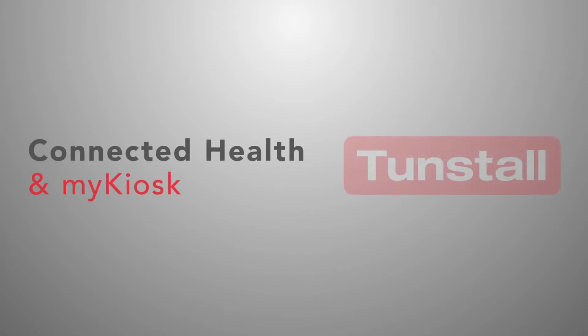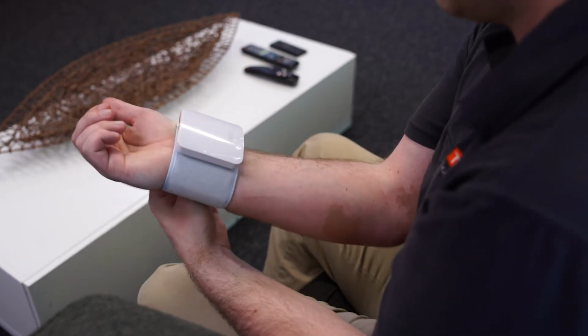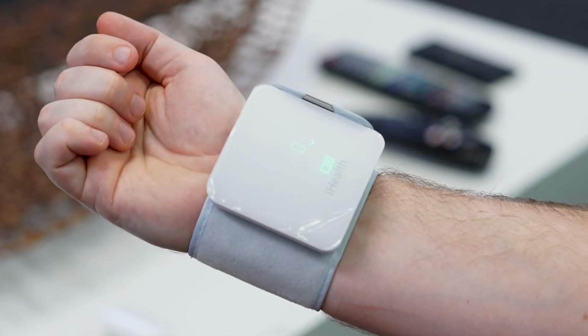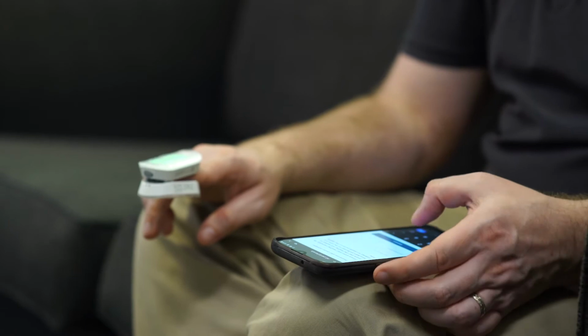Connected Health and myKiosk. What is Connected Health? Connected Health is the consistent and accurate remote monitoring of patients' vital signs and well-being data, monitoring patients with long-term conditions within their own homes.